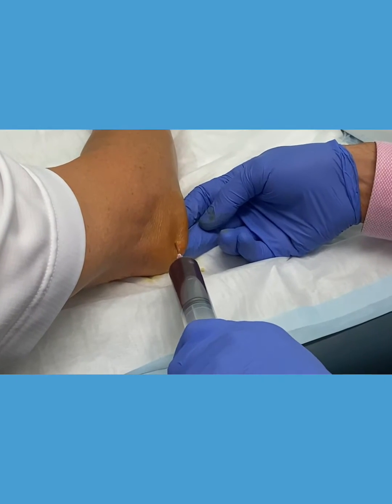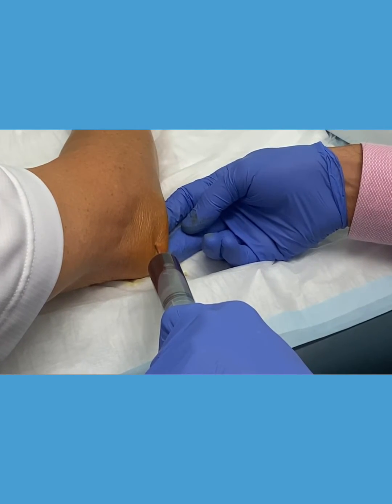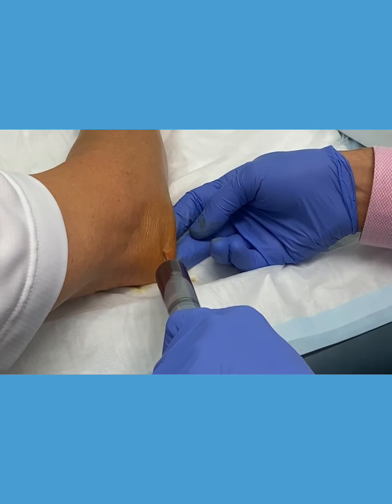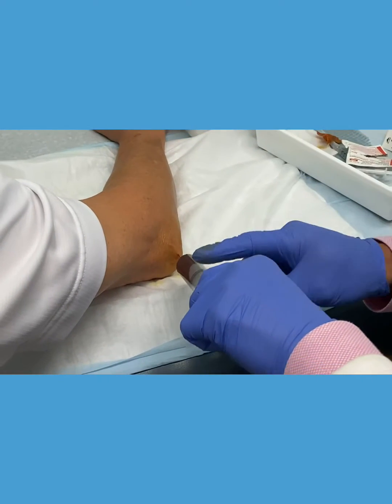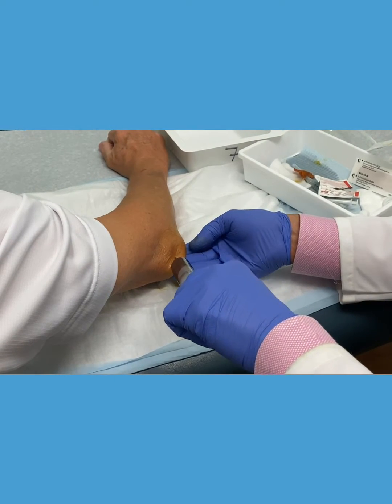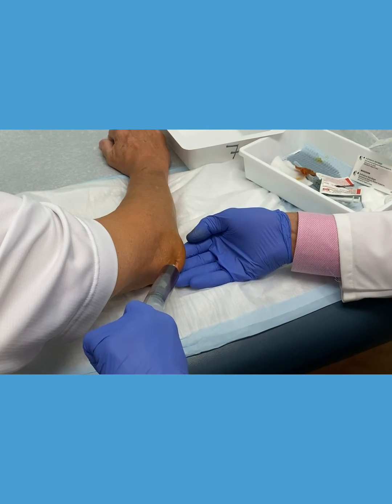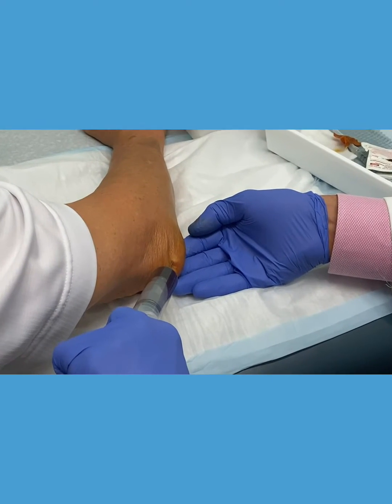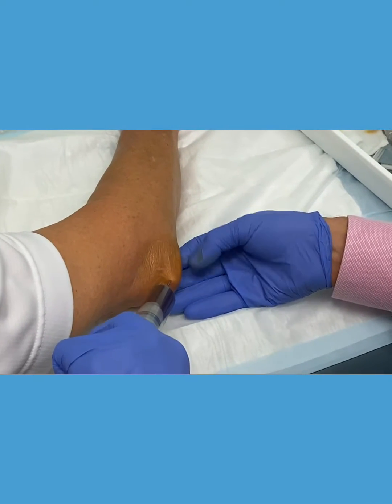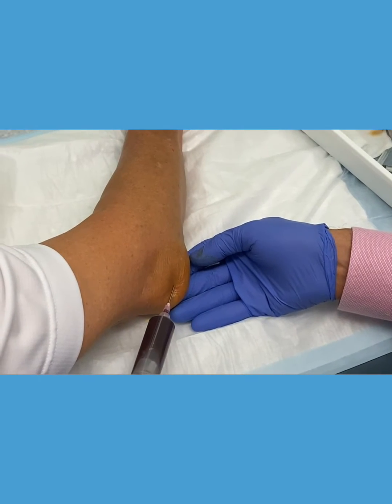I'm finding another little pocket. In this particular case, because it happened following trauma — a single episode — it should not recur. I'm actually lifting up the fluid and going a little bit deeper, getting some more out, redirecting the needle a little bit. It's pretty empty now — I can feel it. I'm going to double check.